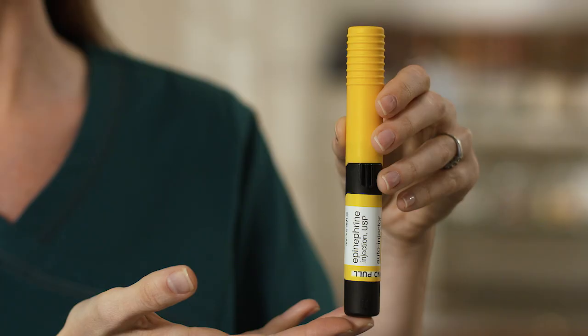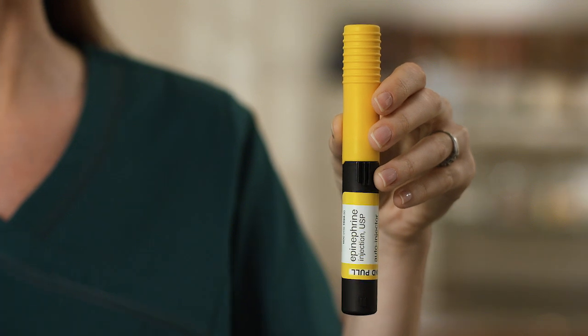Hi there, I'm Linda. I'm here to show you how to use the epinephrine injection USP auto-injector, the authorized generic of Adrenoclick, to treat emergency allergic reactions known as anaphylaxis.